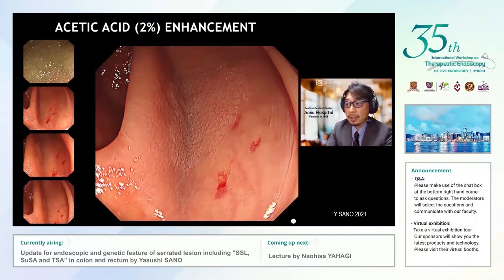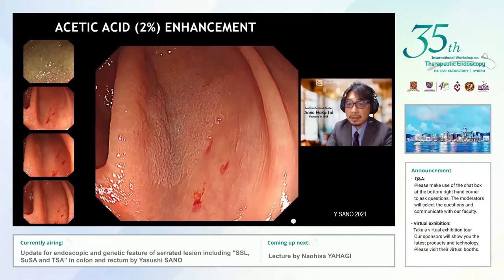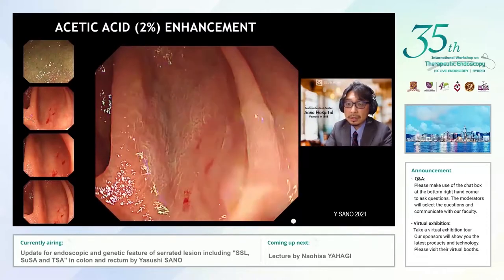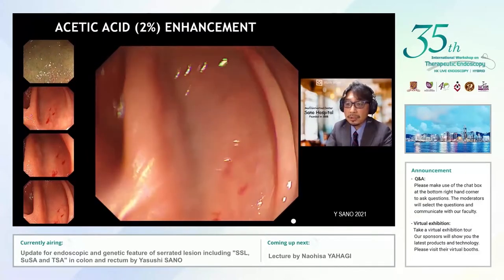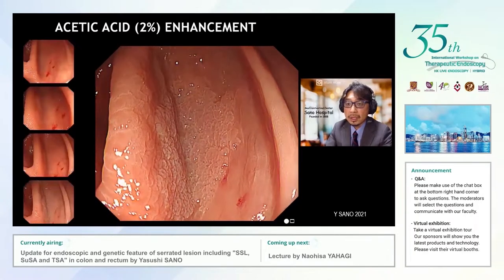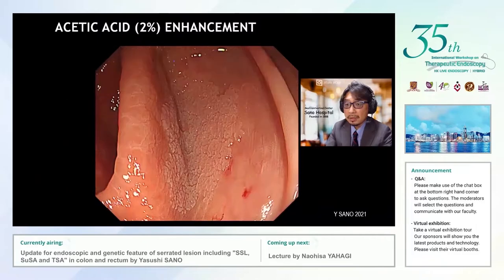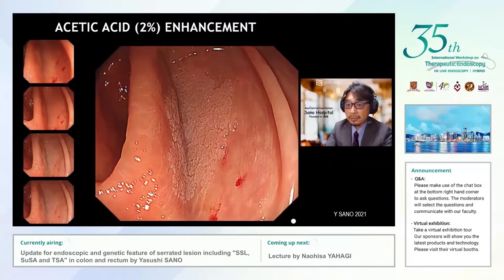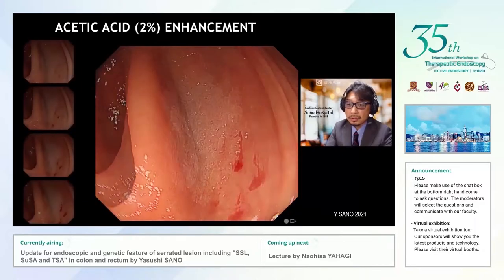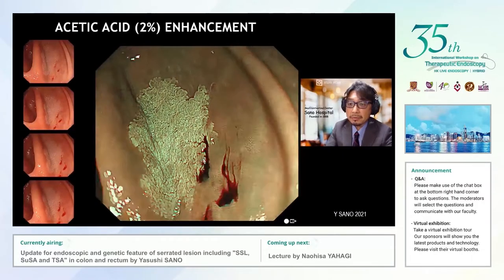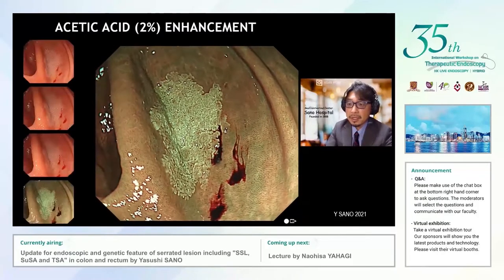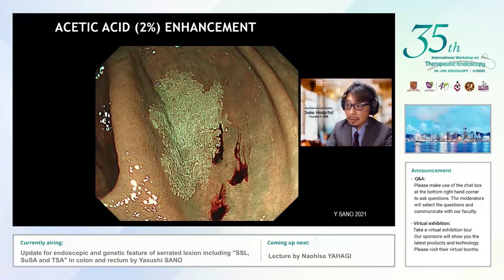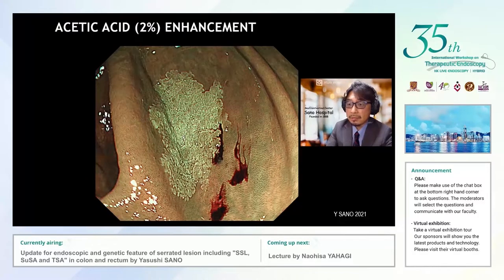I would like to show one interesting video using acetic acid. Acetic acid induces temporary chemical changes to the surface, called the acid whitening reaction, as you can see. The difference in the reaction helps differentiate between normal and neoplastic mucosa. The optical absorption property of the cells can be altered by acetic acid. For this reason, NBI may potentially reveal the white areas as more whitish than white light endoscopy.